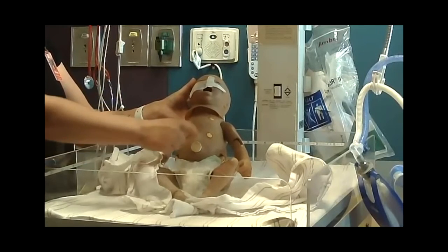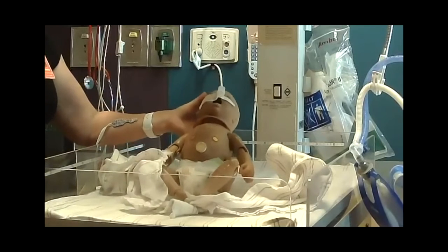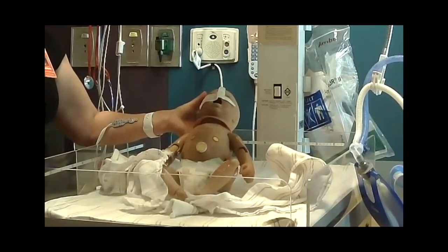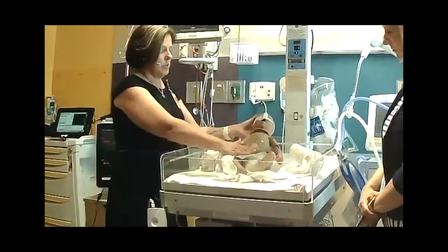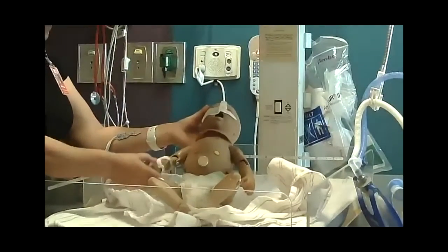You'll have drainage tubes coming out to a little unit that used to bubble, but now it doesn't. It's called an atrium. It drains the fluid from the surgical area. So we want to get rid of that fluid, so those drainage tubes will be there. You'll see they'll have a little catheter to drain their urine, and then they'll have IV lines, all right?